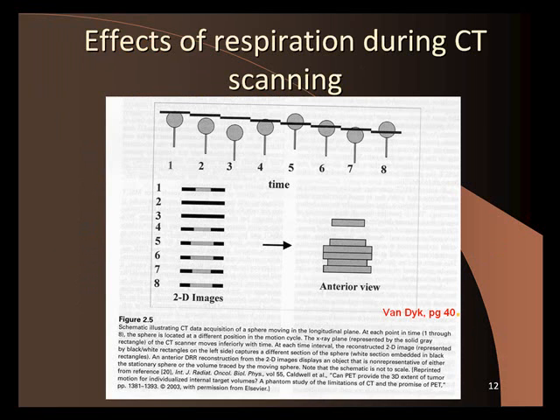So we're talking about sim films, what they're for, how they're generated, how DRRs are generated, and port films and what port films are for. And now we're going to move on to respiratory gating. I said that 4D-CT lets you capture the movement of the tumor. So in radiation therapy, the most important reason to use 4D-CT is for lungs. It's to see where the tumor's moving.